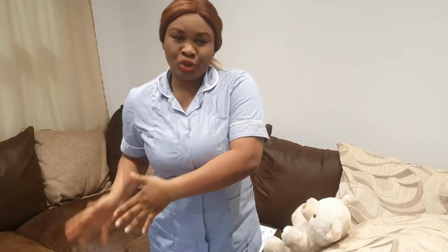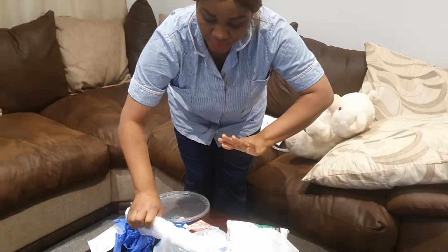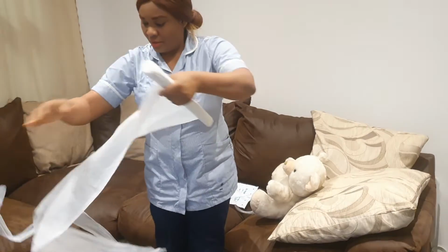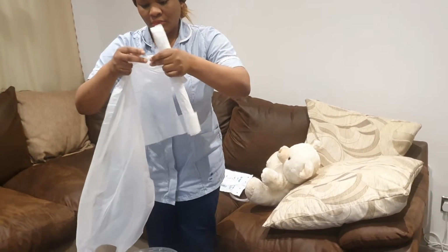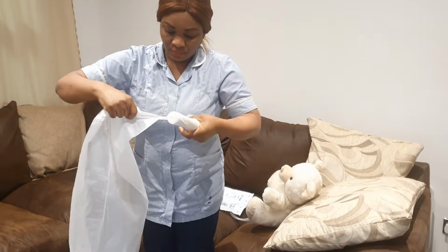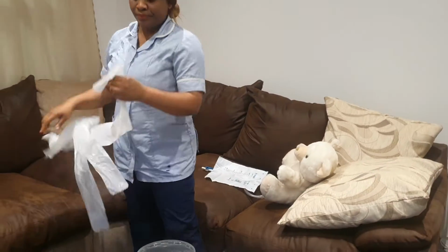Now, what do you want to do? In most cases in your OSCE exam, every equipment has been assembled for you in a tray on top of the trolley. So if it's all assembled for you, you just have to confirm to the assessor: "Assessor, can you confirm every piece of my equipment is clean and ready for use?" And she tells you yes, then you can proceed. But if it's all scattered, you do your hand hygiene, you put on your apron, then you put on your gloves.